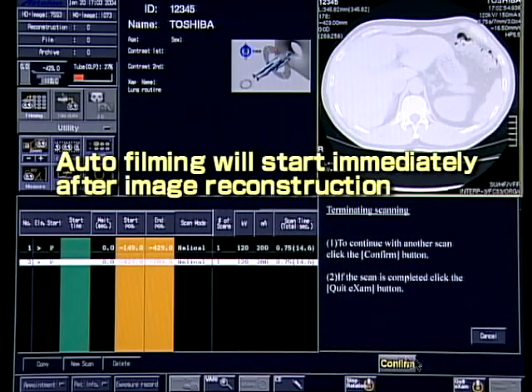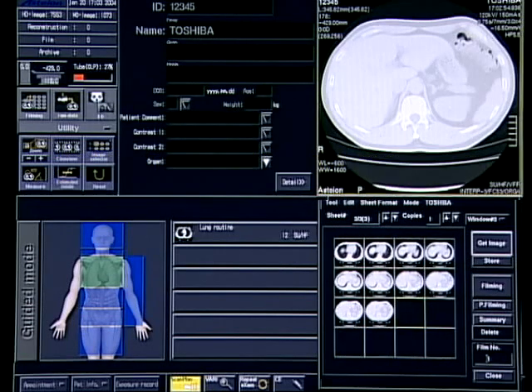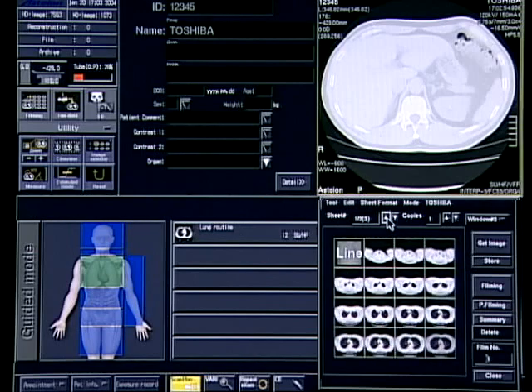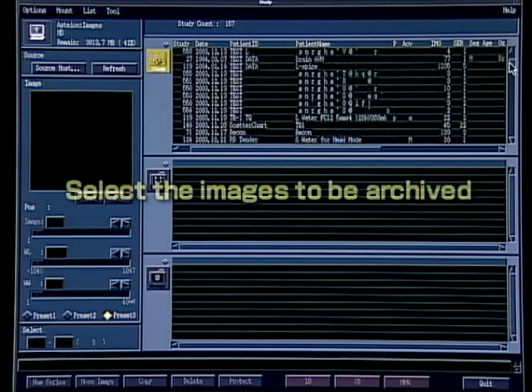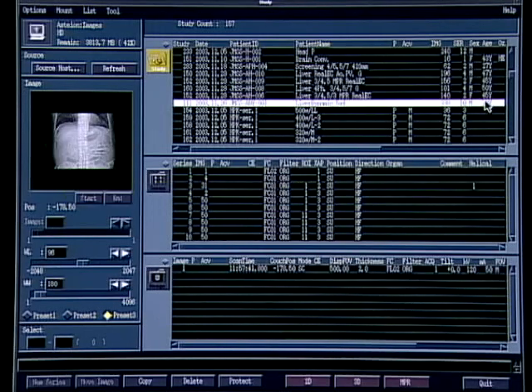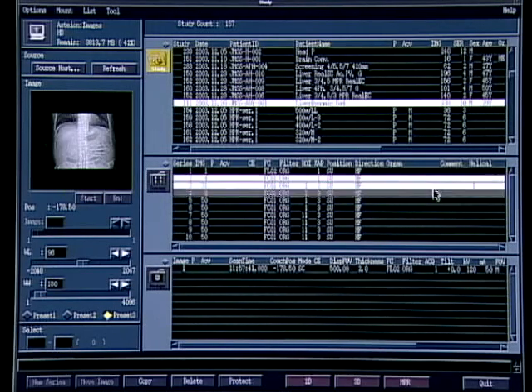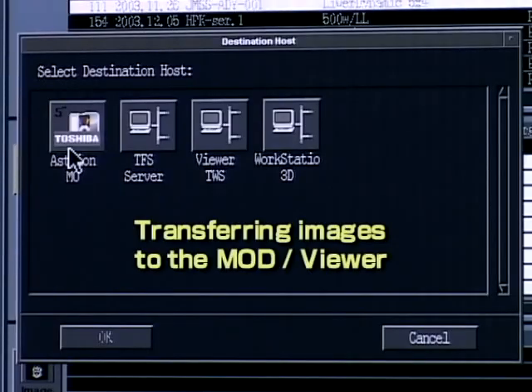When the auto-filming function is incorporated in the scanning protocol, all the steps from scanning to filming can be performed automatically. The procedures for transferring and saving images are also simple. Images can be transferred to multiple destinations at the same time.